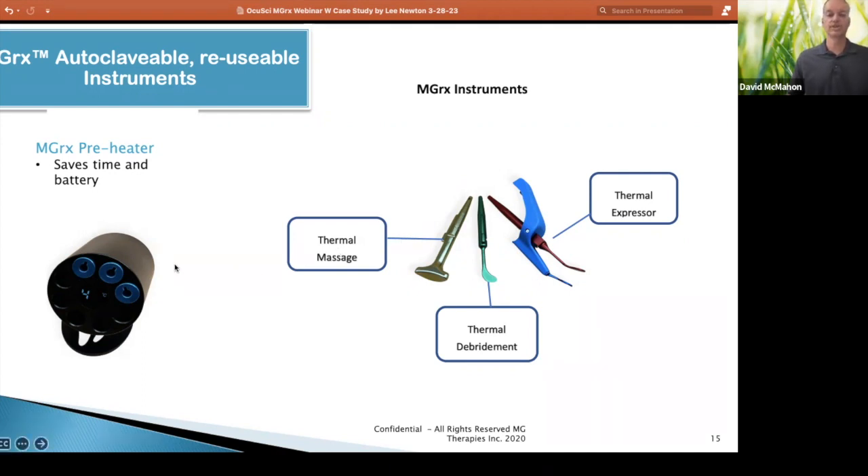There's really no reason to do it that way. We created this preheater such that switching times are more like 45 seconds to switch instruments and get up to temperature. Each of these instruments are autoclavable. You can sterilize them using alcohol — whatever your current method is for any surgical or stainless steel instrument, you can do with these instruments as well.